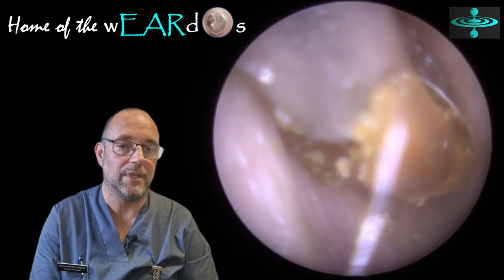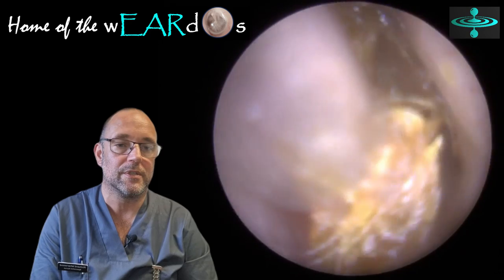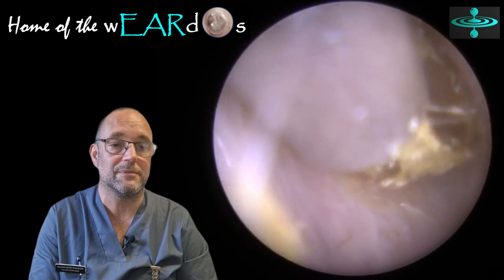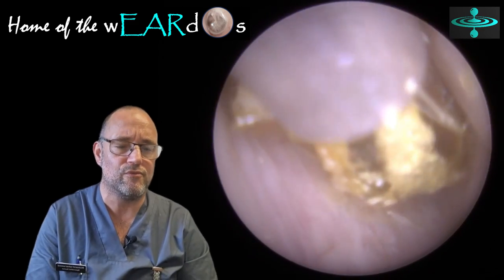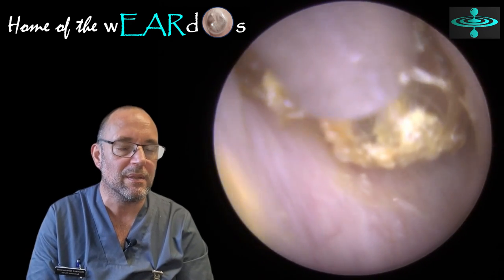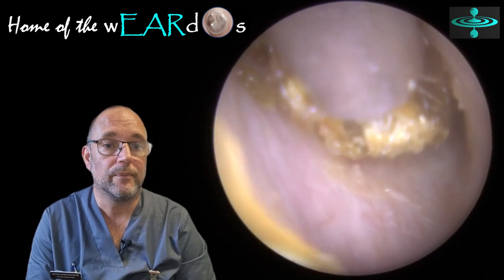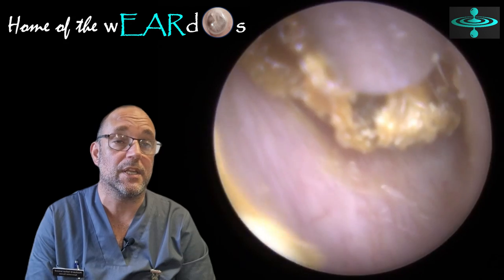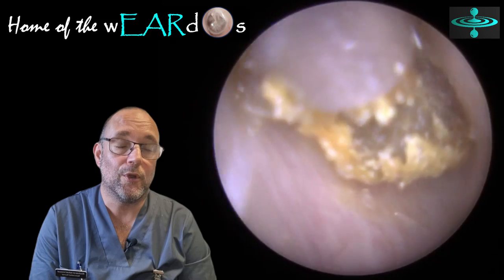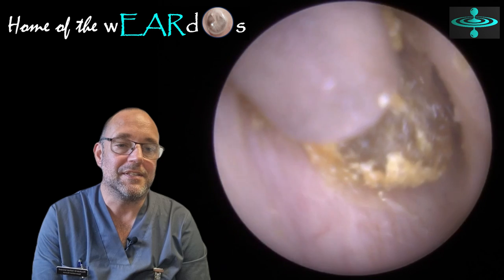There we go — just got a little lift on that. Hopefully we can start finally bringing this thing forward. As narrow as this was, it's kind of the easier of the two. The other one was really impacted — really squashed in with the bud. I don't think he'd ever had this done before, and like I said, he was of a good age. So it could be a year or two's worth in here at least.